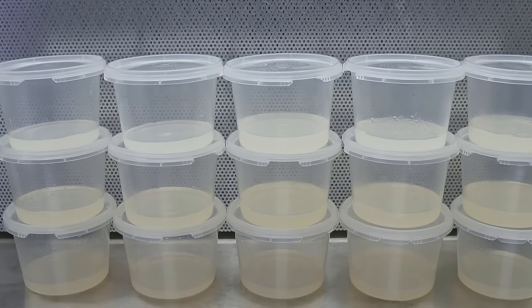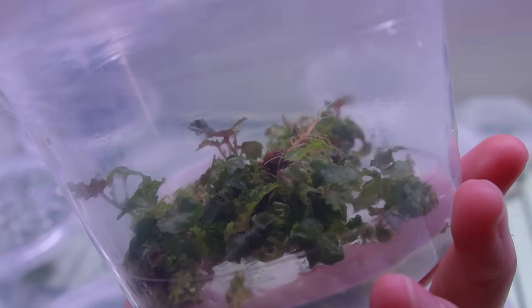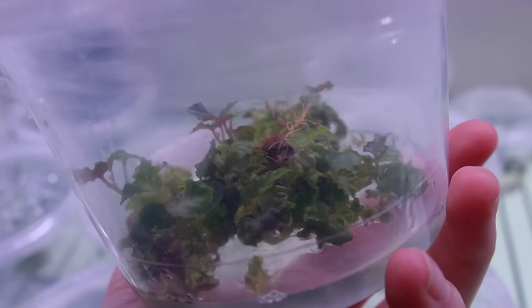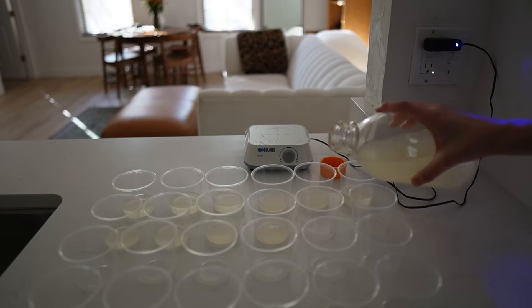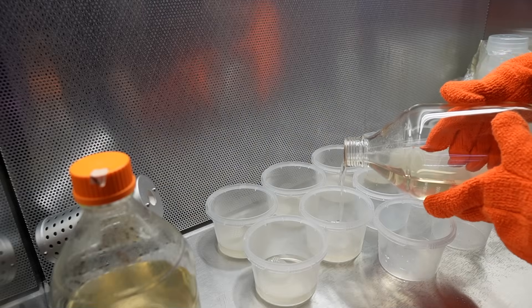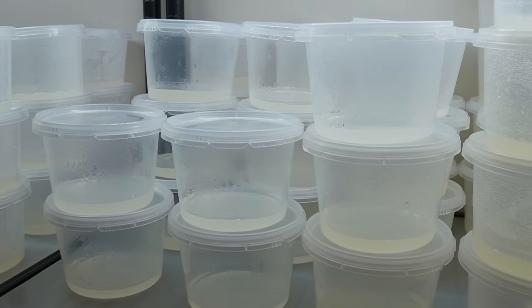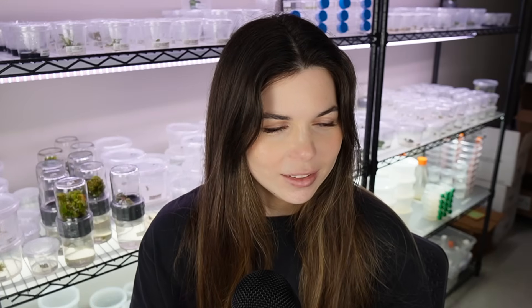Tissue culture media is a nutrient-rich sterile gel that gives plants everything they need to grow and to multiply. Today I'm going to show you two methods for making tissue culture media. In part one I'll show you an easy and fast method for making media at home, and in part two I'm going to show you how I make larger quantities of media more efficiently in the laboratory. Everything I use for this tutorial will be linked below.